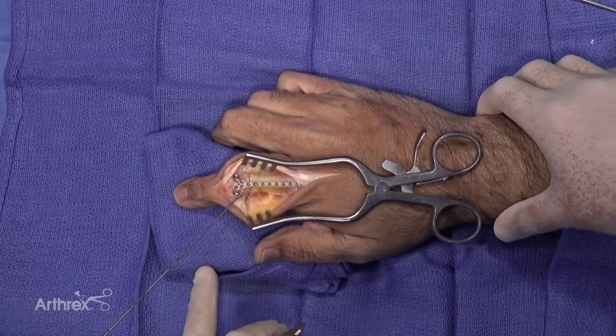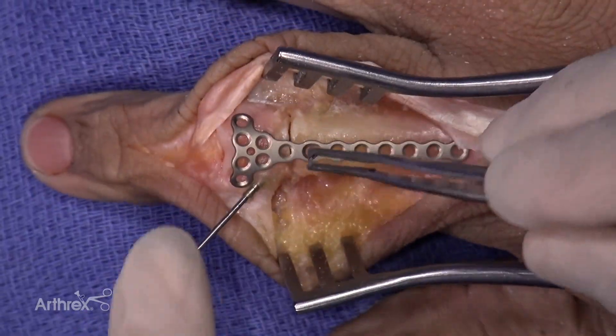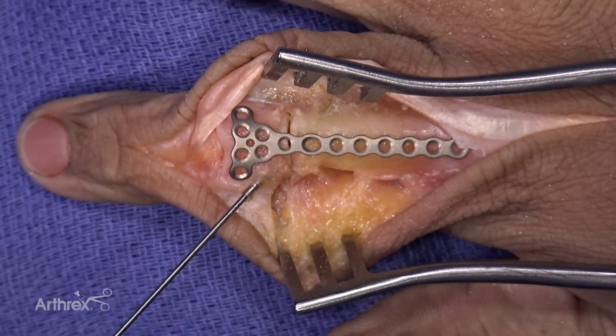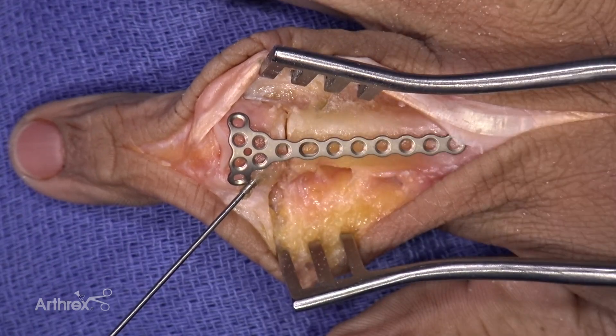Today we have a proximal phalanx fracture in the right hand of a male patient. We've simulated a fracture in the metacarpal neck and we're going to demonstrate the triangular plate. Its usage is interesting because this plate can be used in many different places, especially for periarticular fractures.